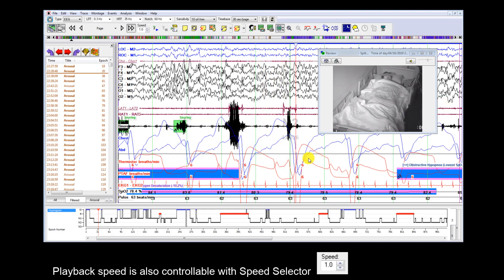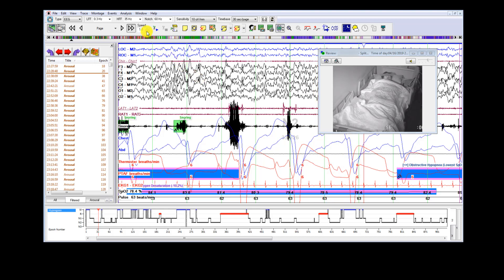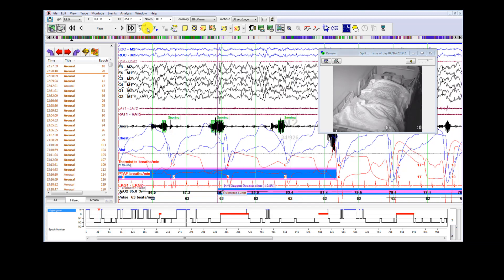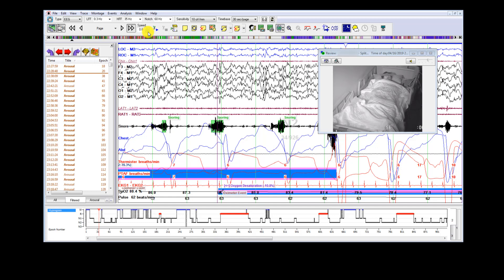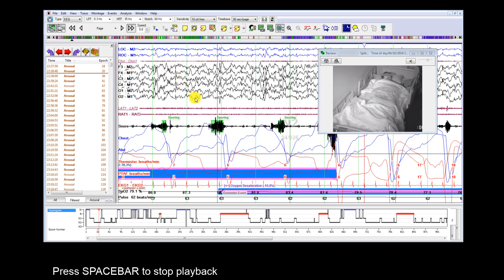Playback speed is also controllable with the speed selector. Press Up for faster and Press Down for slower. Press Spacebar to stop playback.